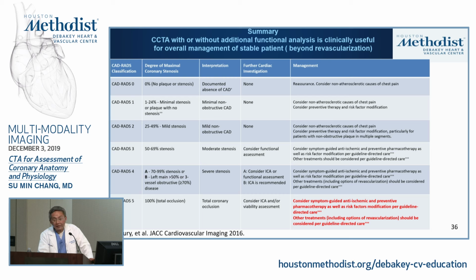If the study quality is not so good, a lot of calcifications, some motion, and the patient has symptoms, I think at this stage, based on the PACIFIC trial that I did not show, PET is probably the best next test to do. And obviously, if you have severe stenosis or total occlusion, I think the decision needs to be based on clinical findings. I think I'm going to stop here, and take any questions.